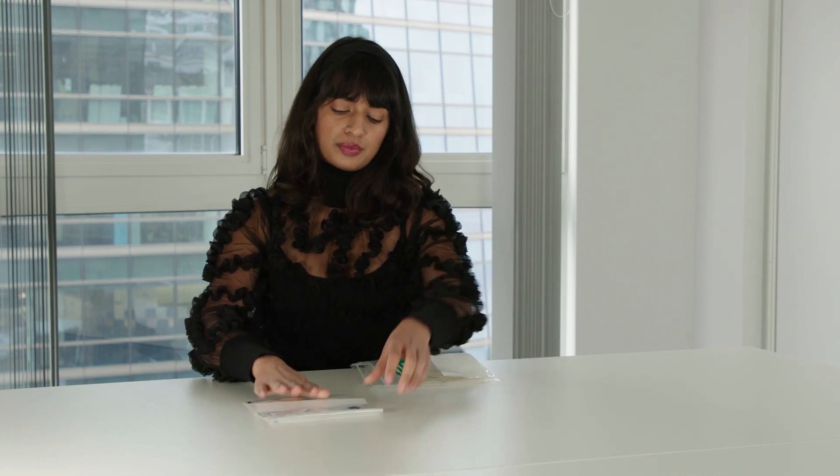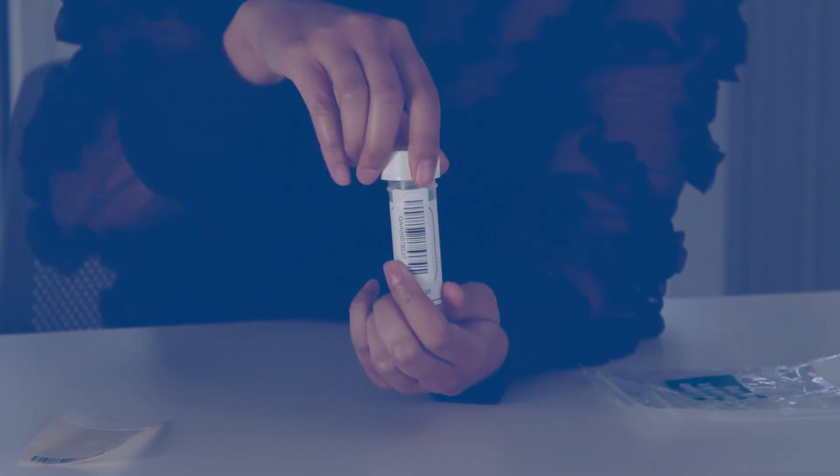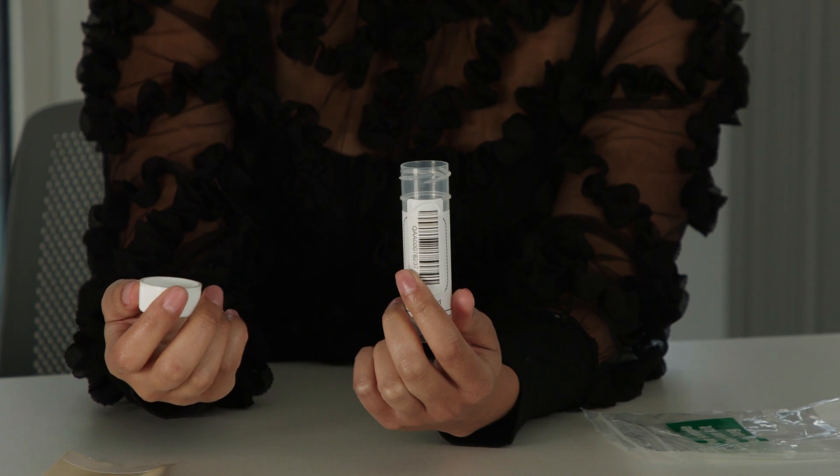Remove the contents from the outer bag. Open the tube by unscrewing the lid. You will only need to submit one tube for each test. To help you create enough saliva for the test, imagine you are eating and move your mouth as if you are chewing.